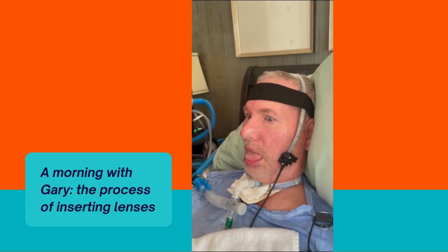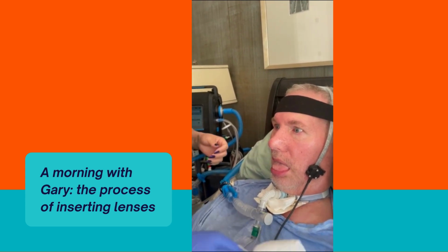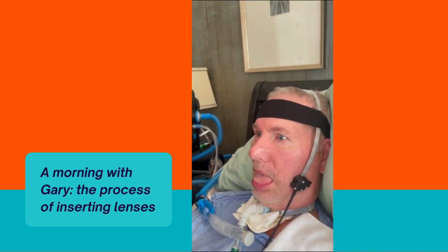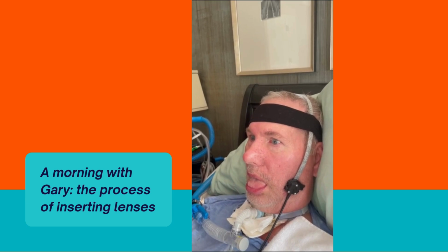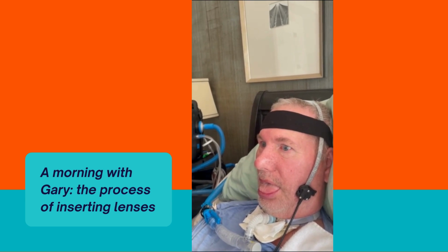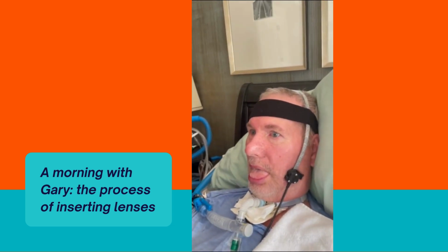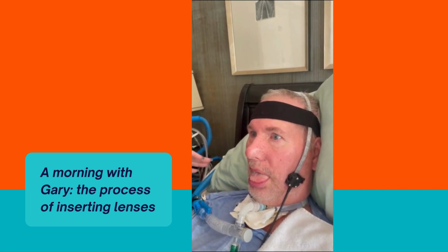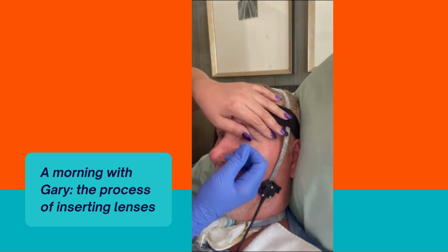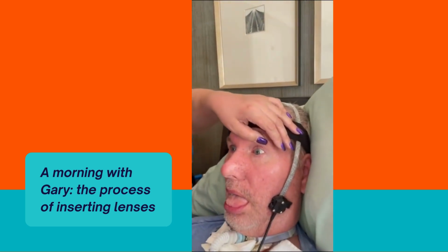The last thing Gary usually asks us to do before he calibrates with Tobii is wipe his eyes. Why does he say wipe my eyes? When you have ALS, and not just ALS, for many different reasons, when you first wake up you have a lot of debris in your eyes. So we do what's called a flush, using eye drops to flush Gary's eyes out, and we wipe them out pretty well before we even do contacts. However, we don't always get everything, so sometimes he'll say wipe my eyes, and that's us trying to get anything that was left in the eye. Also, sometimes when we put the contacts in, you get a little extra liquid in there, and the liquid makes it a little blurry for him.